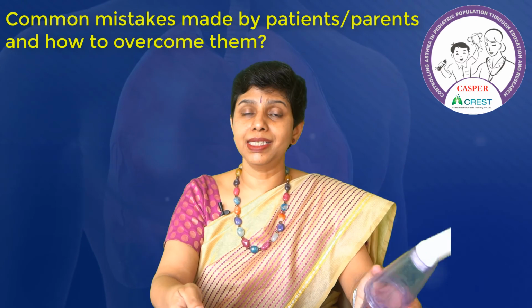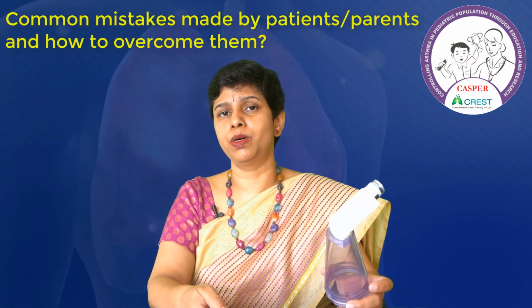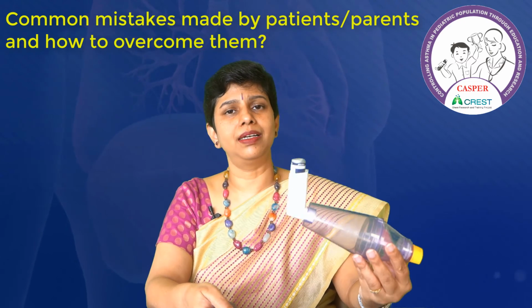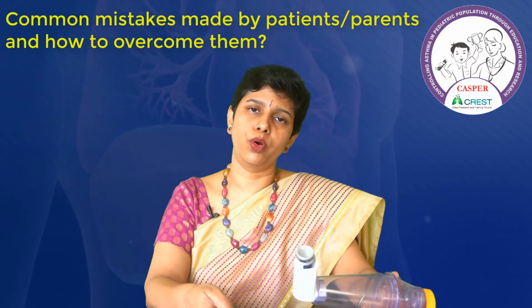So these are the key points that we should remember when using an MDI and spacer. But I would like to reiterate that MDI and spacer is the device recommended for all children.